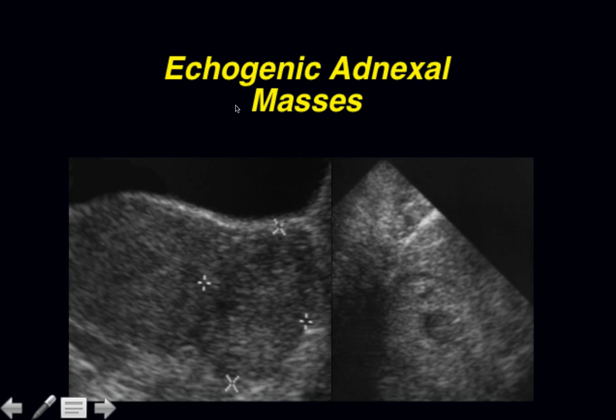Another advantage of the adnexal ring is here we see a patient with an empty uterus and a heterogeneous echogenic mass in the left adnexa. Now her risk is 75%, but when we examine the mass endovaginally, even though it's not absolutely typical echogenic ring, there is definitely a ring-like structure within the hematosalpinx, which to me increases the probability significantly that the patient actually has an ectopic pregnancy. Therefore, I would upgrade the level of risk. I would stratify her risk to a higher level than 75%.